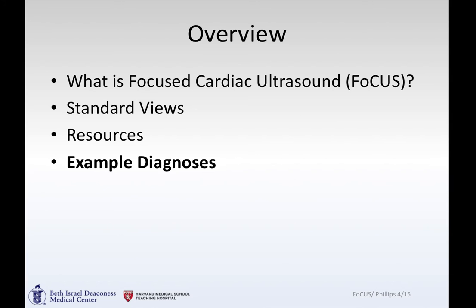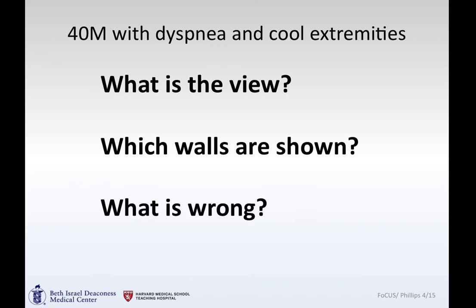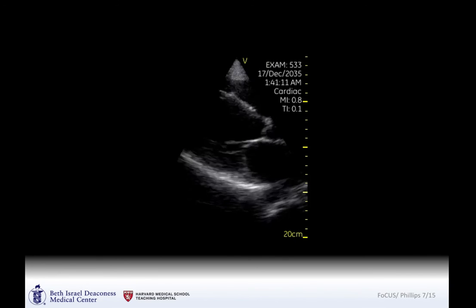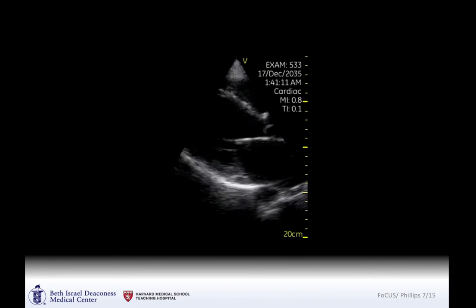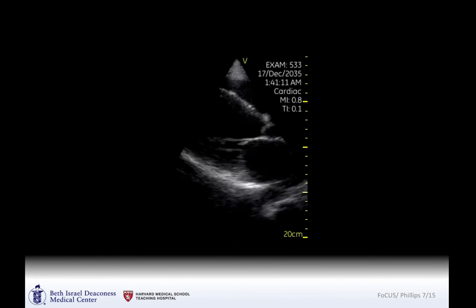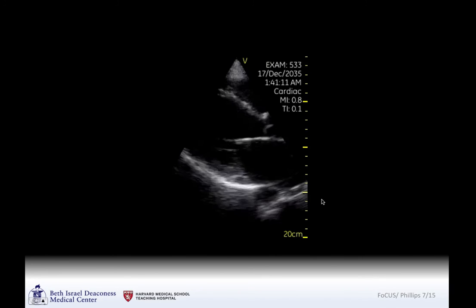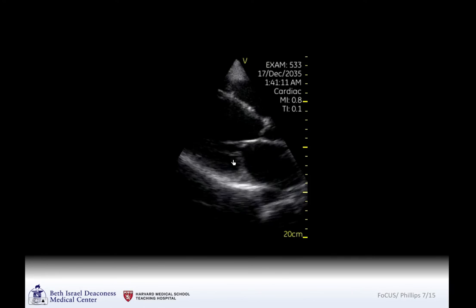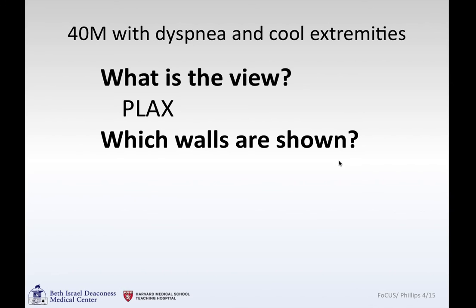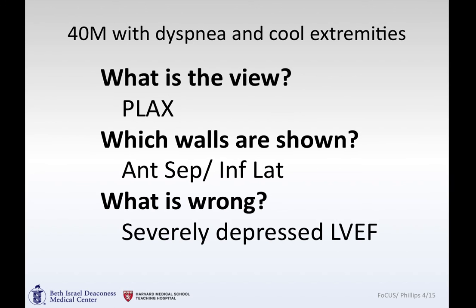Now for example diagnoses. A 40-year-old gentleman presented with shortness of breath and cool extremities. After a quick exam, handheld ultrasound was used to look at his heart. The depth is 20 centimeters rather than the typical 14. We've got the aortic valve and mitral valve in the same view, so anterior septum and inferior lateral wall — this is the parasternal view. Grossly, the left ventricular function is depressed. Parasternal long, anterior septum, inferior lateral wall, and severely depressed left ventricular ejection fraction.